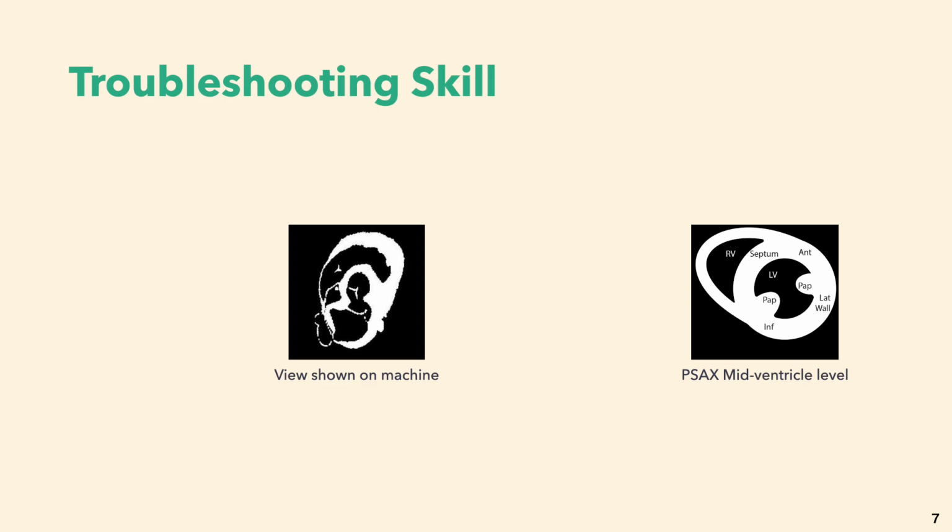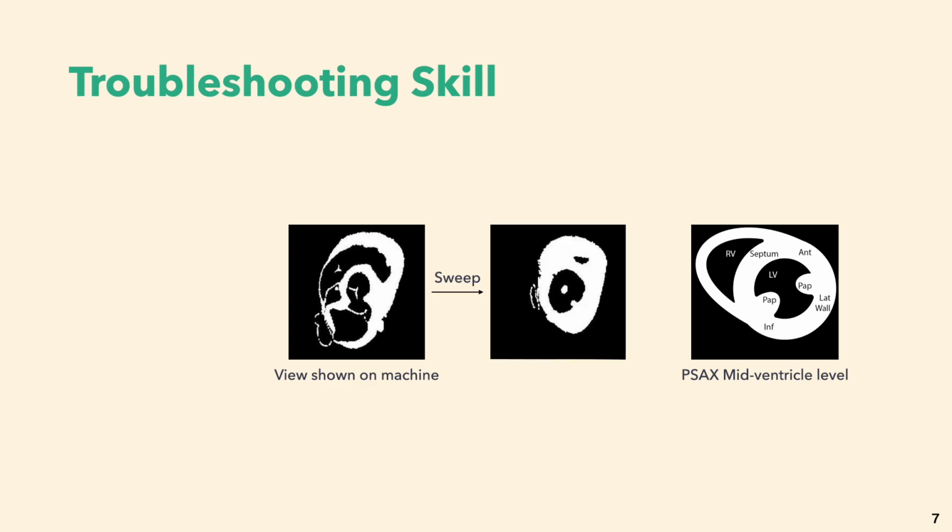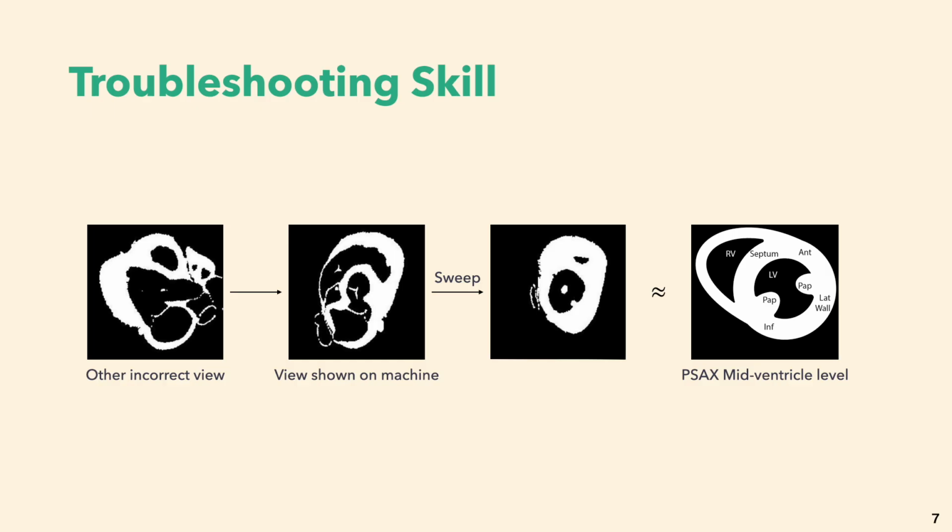It involves learning common strategies, such as sweeping the probe downward to achieve the parasternal short-axis view and applying this approach in similar cases. Moreover, trainees may use an intermediate step, first achieving the left image if it's easier.